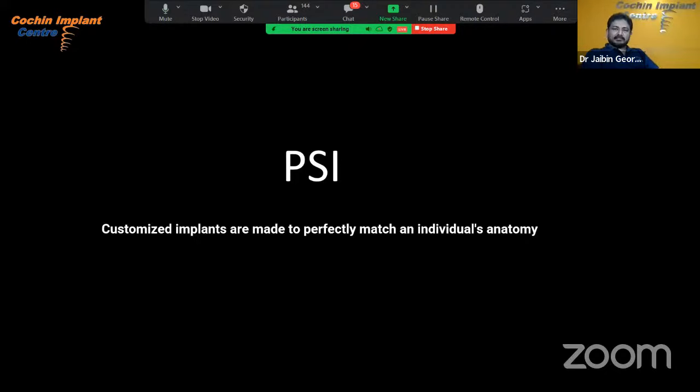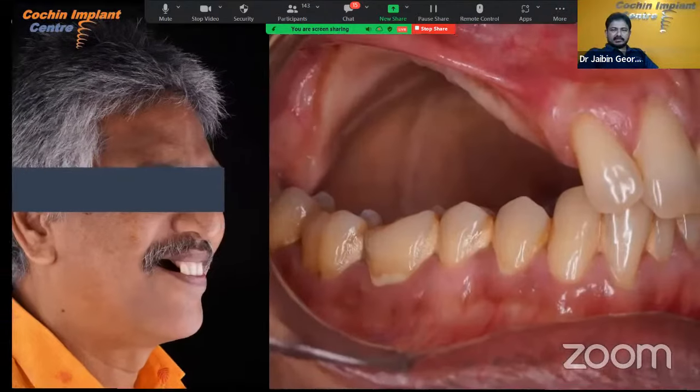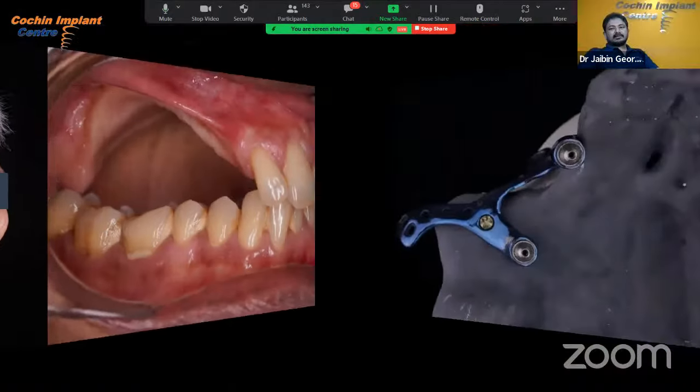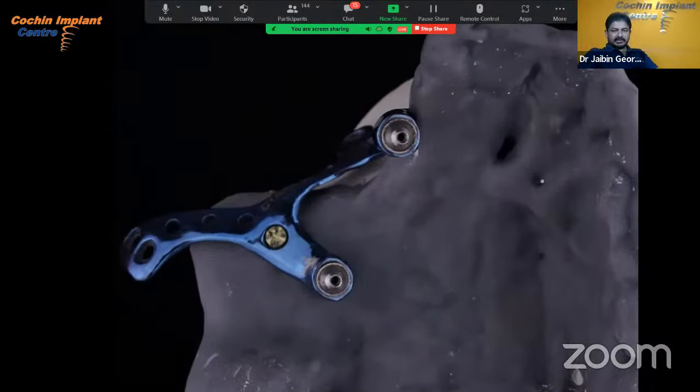This is something like a subperiosteal implant. In this case, the patient had a tumor surgery and there was no bone to place conventional implants. So we made the scan and a PSI, patient specific implant, was made. And you can see the multi units attached to the patient specific implant. And this is the 3D printed model.